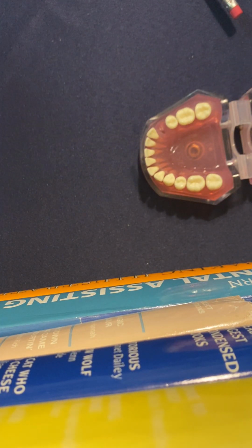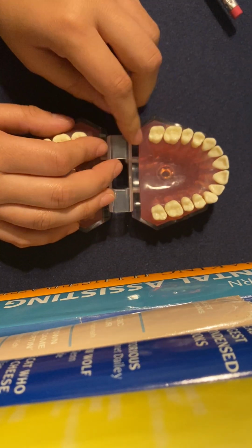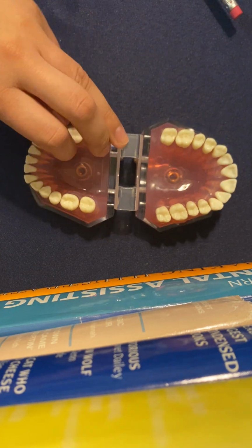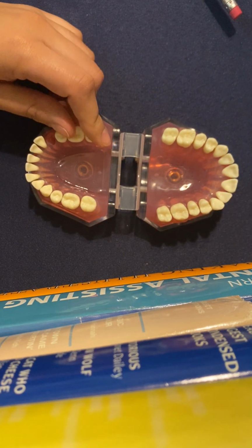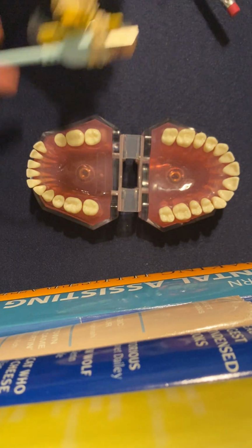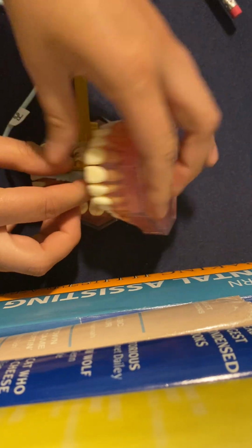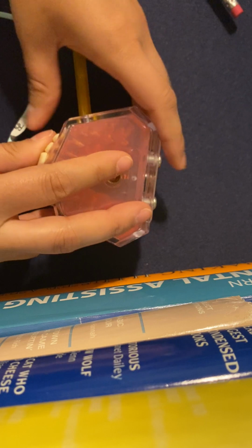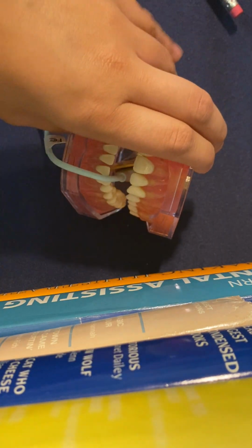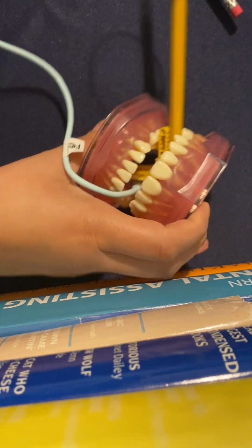Number 14, mandibular right molar. So, deep right here. For the mandibular right molar, you're going to want to center it on the second molar. Like I said, push that tongue over. Bite down. The teeth that you're going to want to see are the first, second, and third molar, crown and apices. So you bite down on it again.